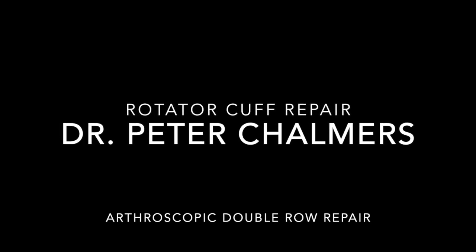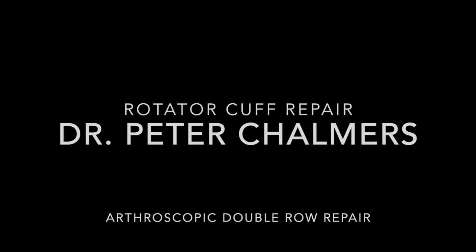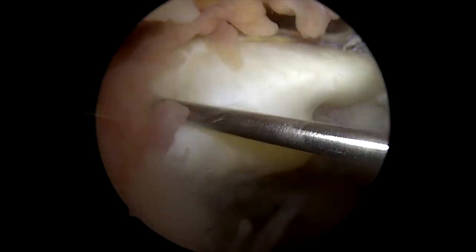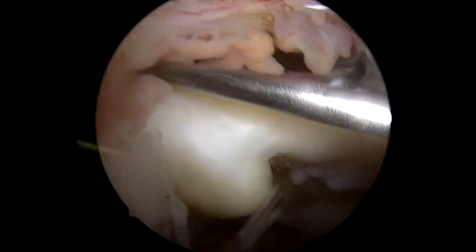We're going to start with our arthroscopy here in the subacromial space. You can see our tendon edge right there that I'm manipulating with the spinal needle. You can see it's quite medialized here, but we have pretty robust tendon tissue. We're going to need to bring that all the way back to our tuberosity.